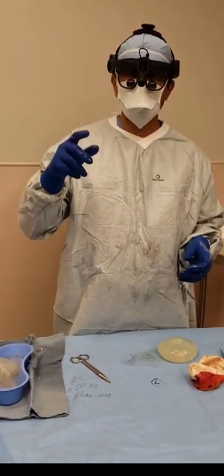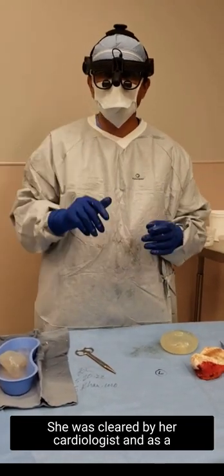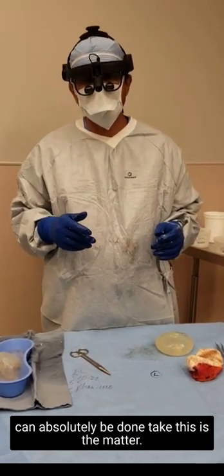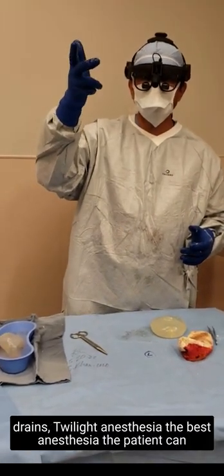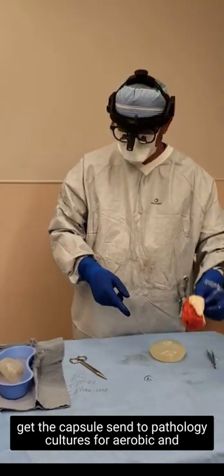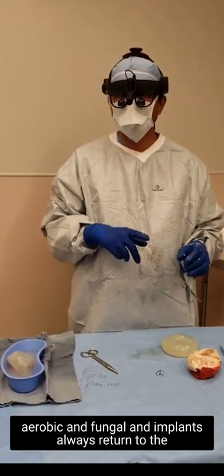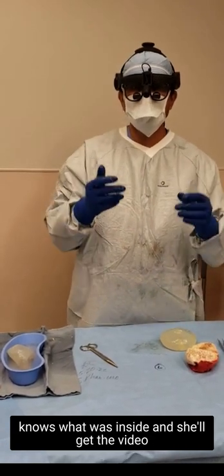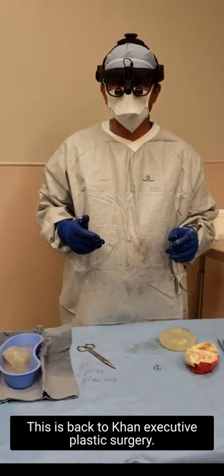She did not have any compromise — she's actually going to go back on her Plavix tonight. She was cleared by her cardiologist, and as a result it was done at the hospital, and the surgery can absolutely be done safely. No lift, no drains, twilight anesthesia — the best anesthesia the patient can get. The capsule sent to pathology, cultures for aerobic, anaerobic, and fungal, and implants always returned to the patient — even this ruptured one — so that the patient knows what was inside. She'll get the video as well. This is back to Khan Aesthetic Plastic Surgery. Thank you.